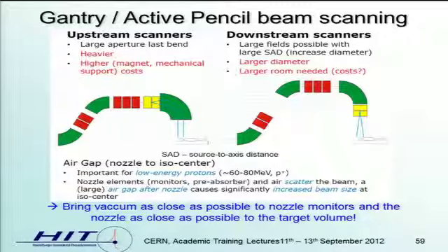What you have to choose, if you want to use scanning, is where to place the scanners. You can do that after the last dipole.